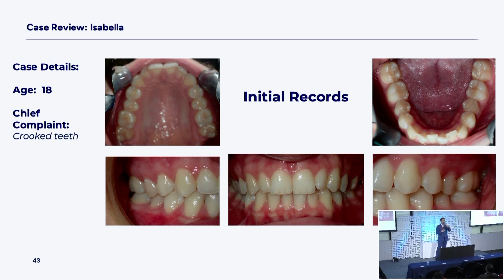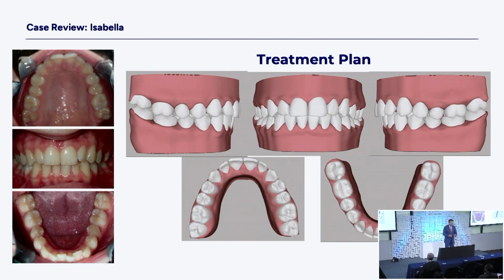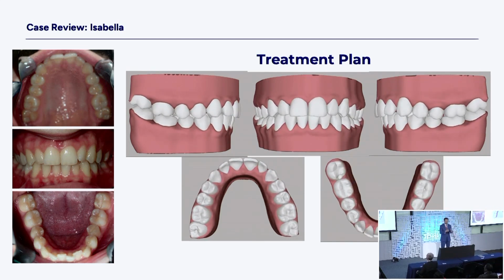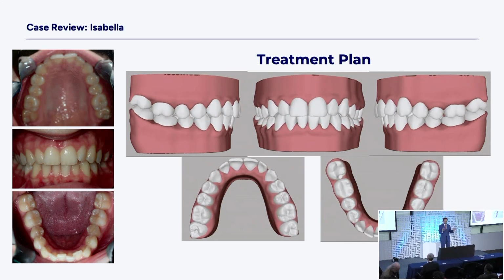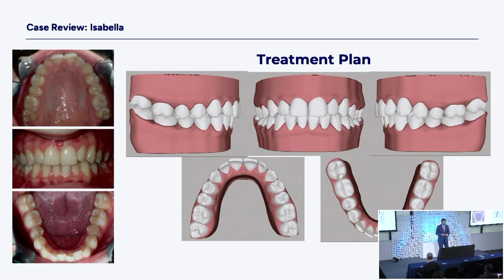But when you have a little less crowding on top than on the bottom, all of a sudden you know, uh-oh, I have to move those bottom teeth a little further, the top teeth a little further, it's going to mean a space. So here comes a little space. Here comes the movement. So again, the treatment plan, upper arch, I want to see the back teeth getting wider, the front teeth going forward. Back teeth wider, front teeth forward. Just like the little grid we drew to avoid IPR, expand and procline. And it does develop a little space at the upper laterals.